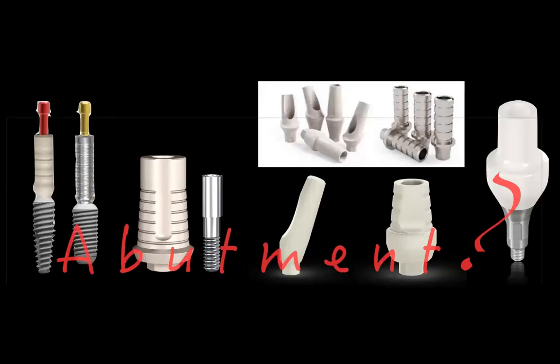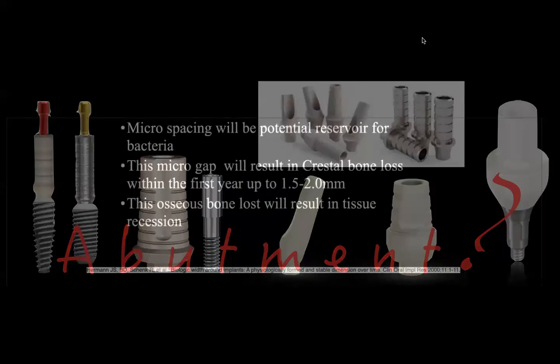These are a few examples of the temporary that we are talking about. They make them plastic because it's much easier to prepare, and you don't want to prepare the metal temporary because the metal just flies all over the place while you're doing the surgery. So that's definitely a plus. But what do I use? What's the thought process with this?